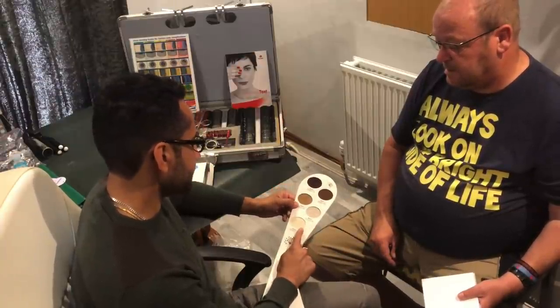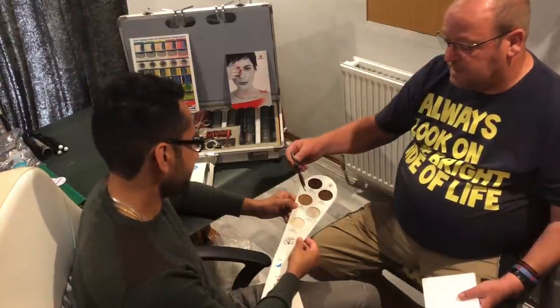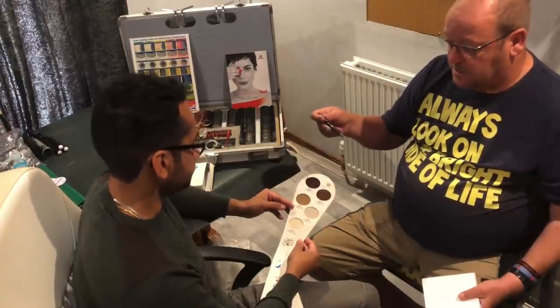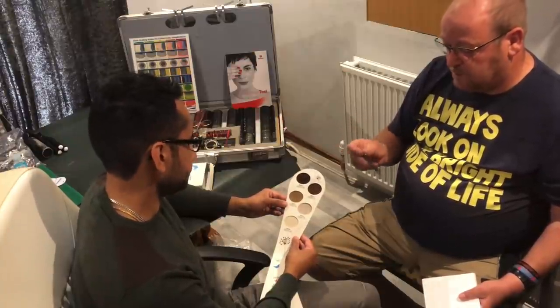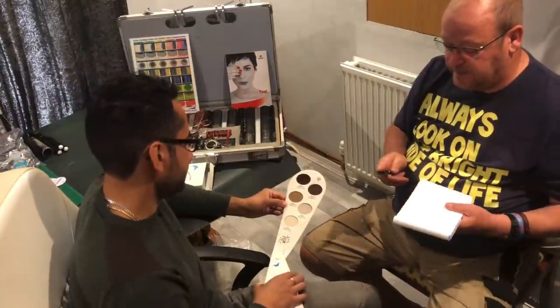I think this would be nice for my driving spectacles. Another advantage of having the brown — there's yellow into brown, and yellowing of the lenses can help slightly to enhance. But we'll come to a better colour than this as we go along. So that's a maybe. Definitely a maybe.